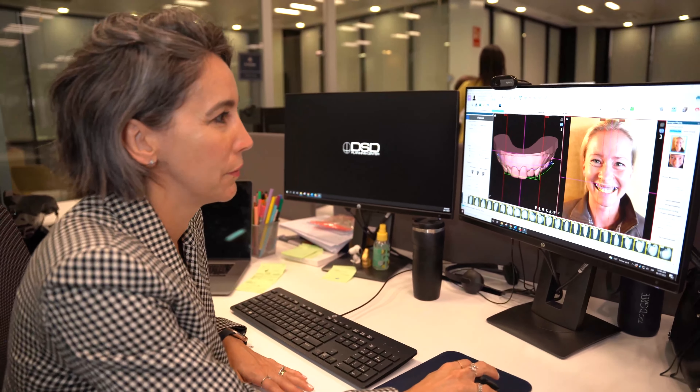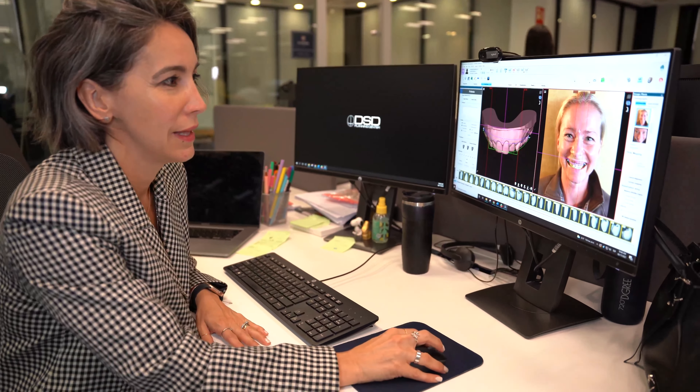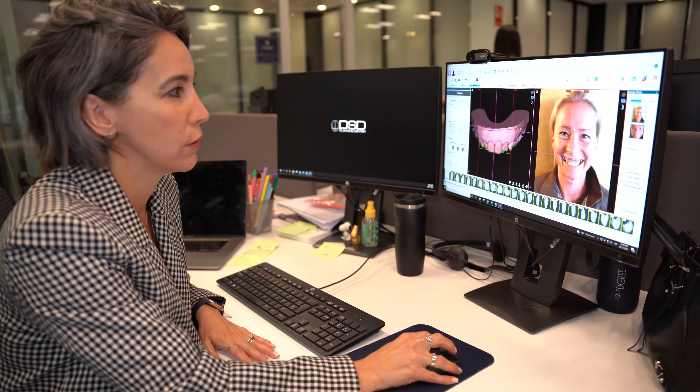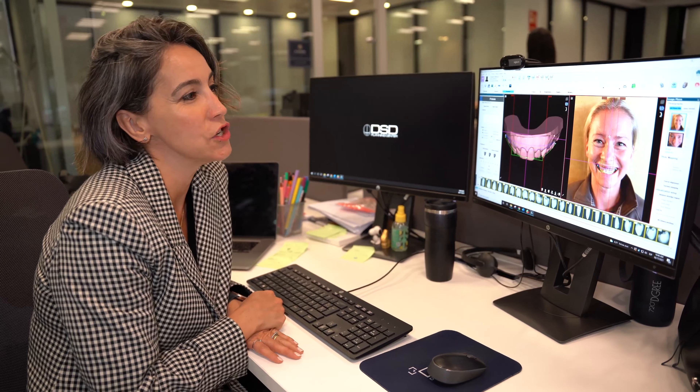Here we set the midline and then the smile curve where we think her teeth should be ideally according to her face. Once I have this ready, the case goes to a designer. Lorena is our main designer in the DSD interdisciplinary team and she will be working with this case according to the smile frame that I designed for her.